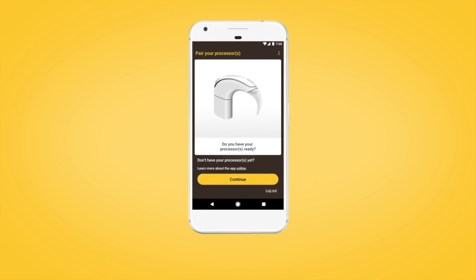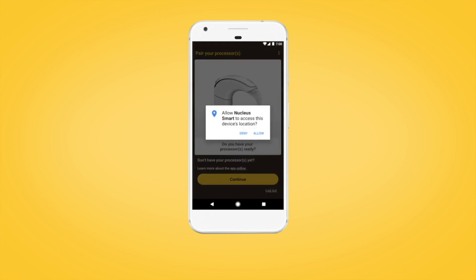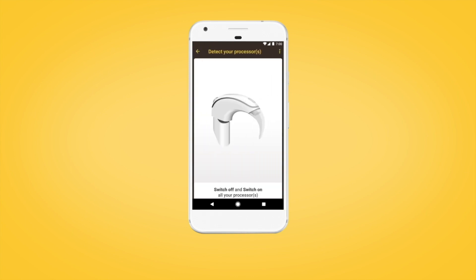When you have your sound processor and are ready to pair, on the Pair your processor screen, tap Continue and follow the prompts to allow location access. This enables your Android device to detect your sound processor.